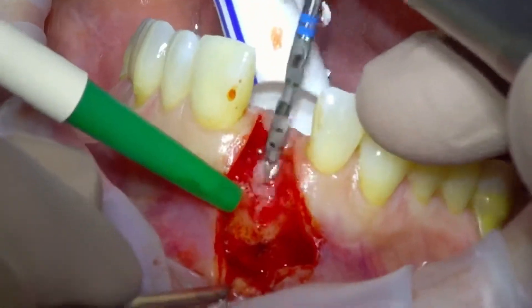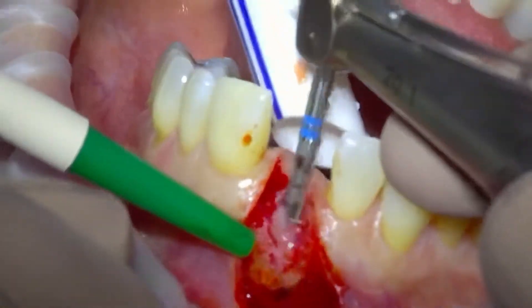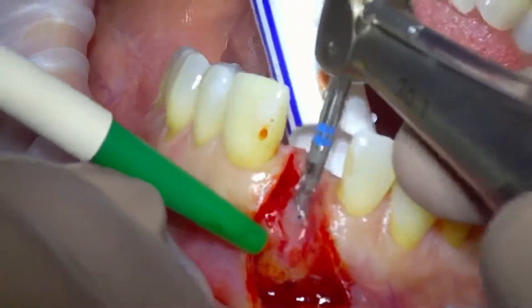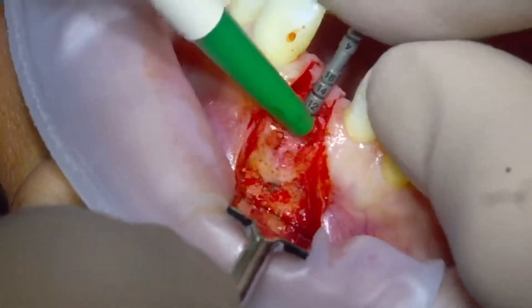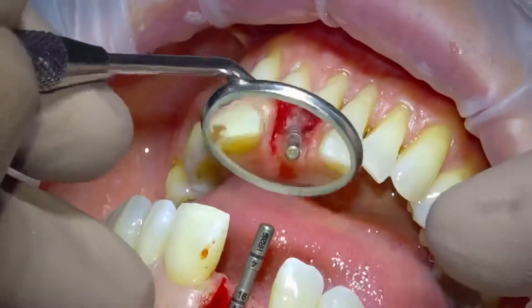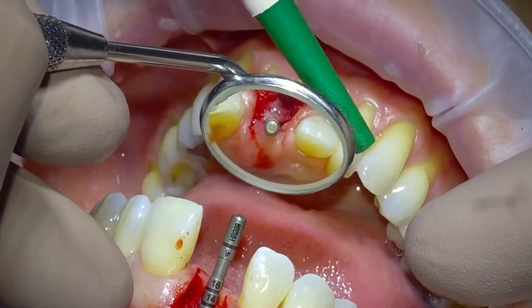It's a 12mm implant fixture. We just move through the drill sequence, ensuring the RPM is correct. That's our direction indicator, just making sure that the osteotomy is in the correct planes — bucco-palatally and mesio-distally, and apico-coronally.